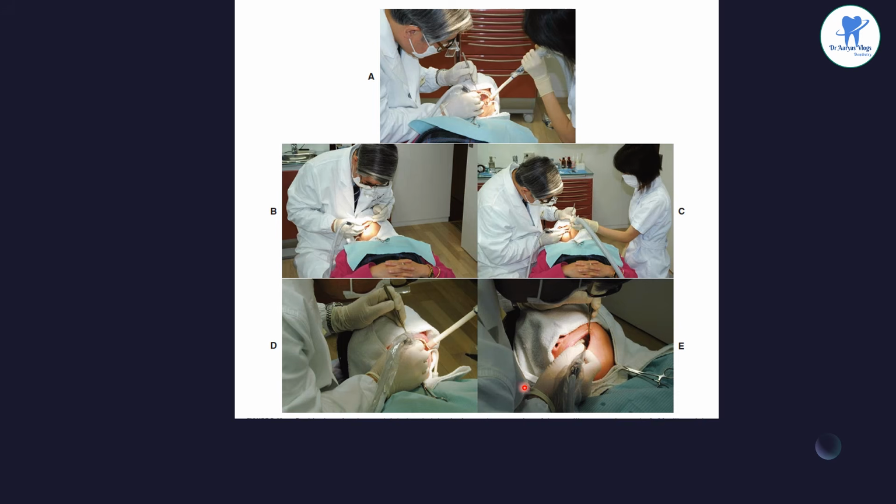The dentist is at the 9 o'clock position. The dentist's access is improved by having the patient tilt the head, partially close the jaws and move the mandible in a left lateral excursion.